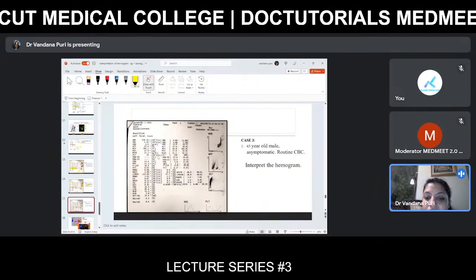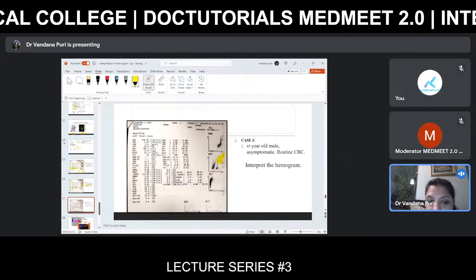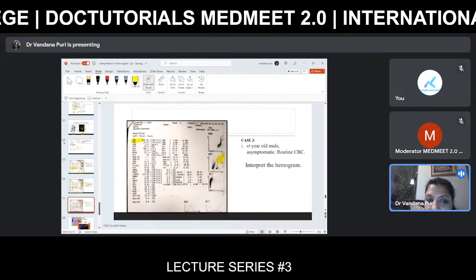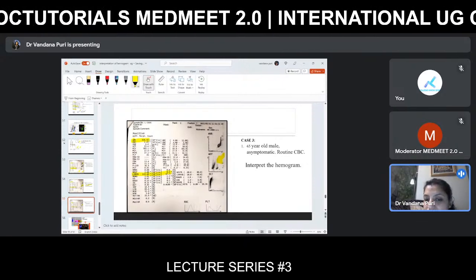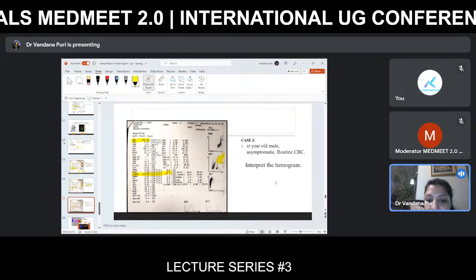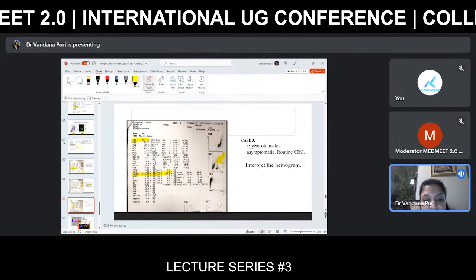Now let's look at this curve again. Instead of the curve which we have seen here, look at this here. Here you are getting a peak only in the lymphocytic region. Their WBC count again is very high, and the peak region is only in the lymphocytic region like this. And if you look at the platelet, the patient also has thrombocytopenia and you can see multiple peaks here. So probably either the patient is transfused or he has agglutinates.